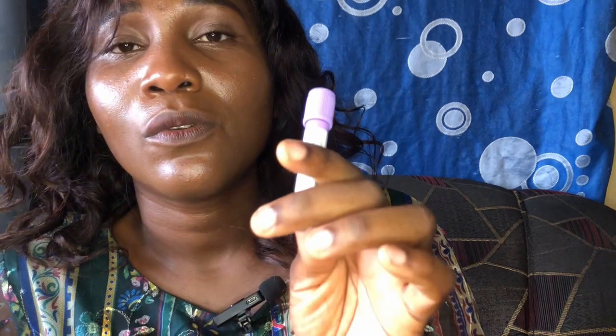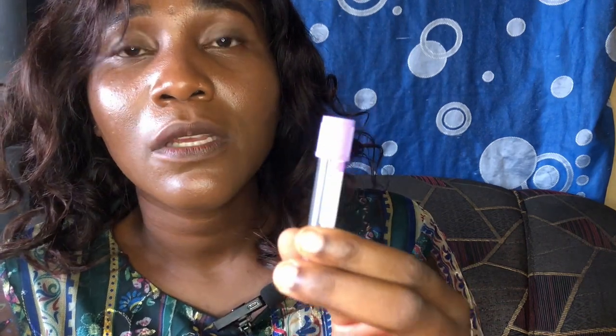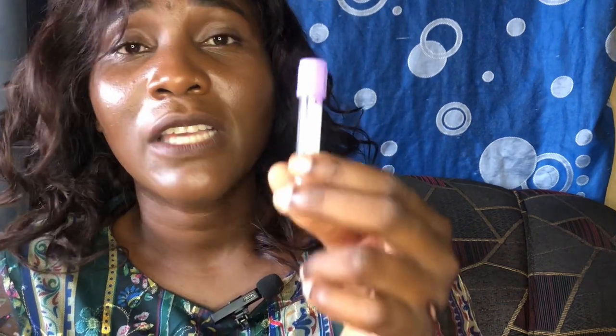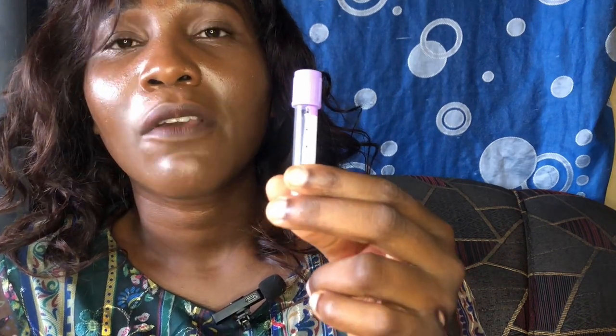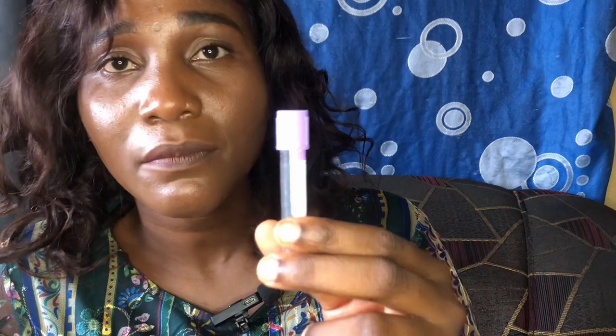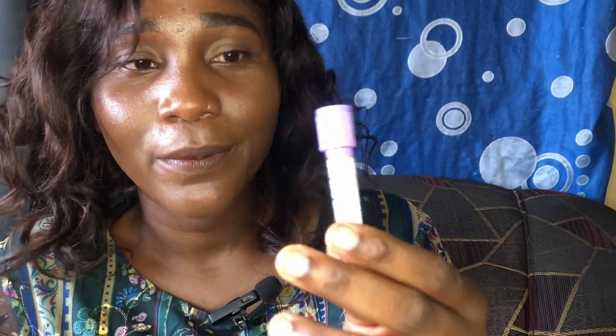Maybe you want to do a full blood count, a complete blood count, you want to check your platelet count. It's going to retain it just the way it is in your body, in vivo. It will retain the blood cell morphologies, and you can do a good study on your microscope.